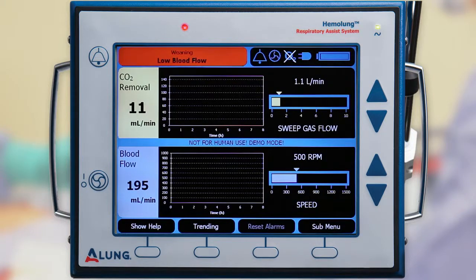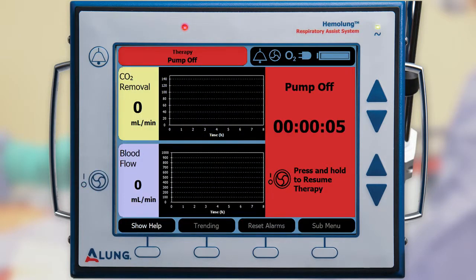Reduce the pump speed to approximately 500 revolutions per minute. Press and hold the pump start/stop button to stop the pump. Once the pump is stopped, it is important to complete the remaining steps as quickly as possible to decrease the risk of blood clotting.